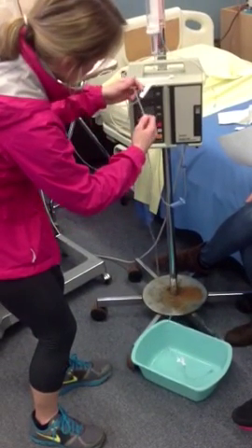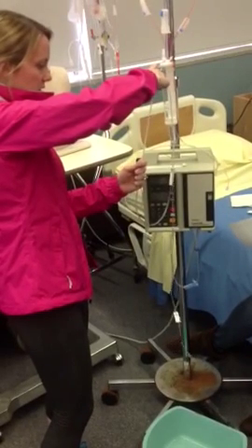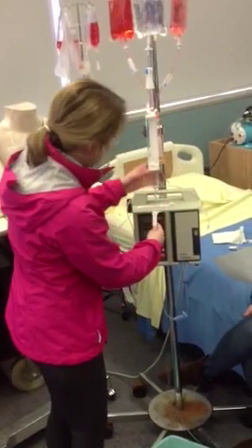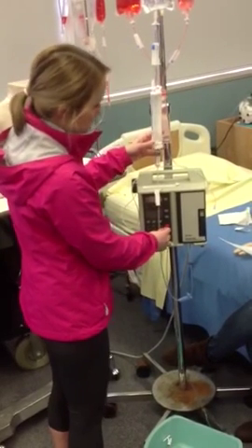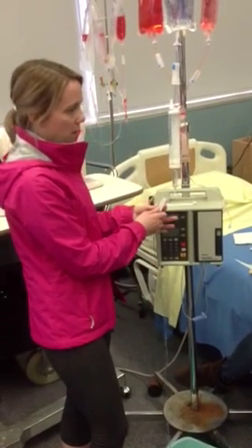We're going to check for bubbles — there are a few. We want to get rid of them all. Once all those bubbles are gone, we would be able to hook the IV up to the patient and then set the drip rate with the bottom clamp.